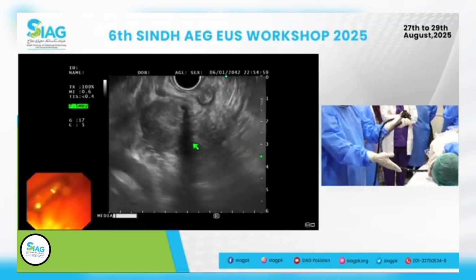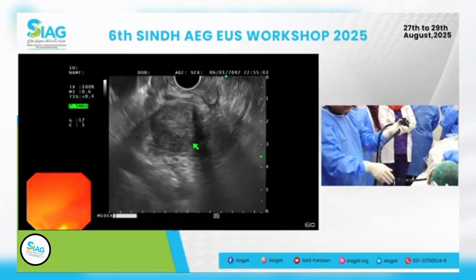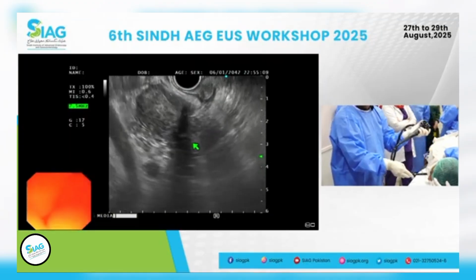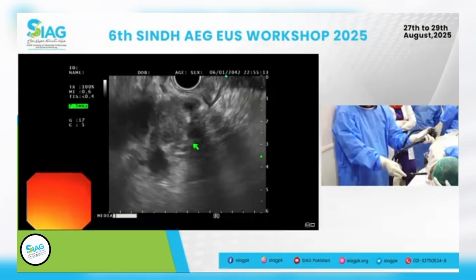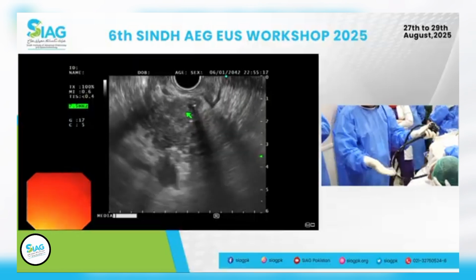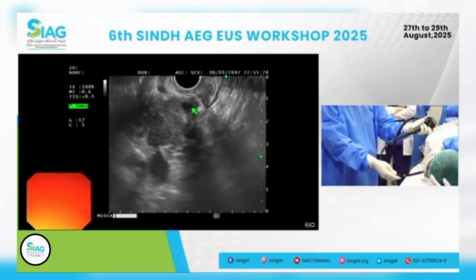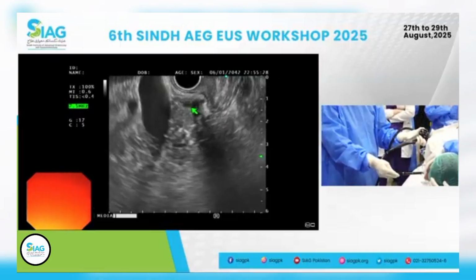So same movement, big wheel towards you. I'm sitting in that position, suctioning. I will move the scope gently in to oppose against the wall. That stabilizes me right there. Now, if I have to go to the liver hilum, I know there is a stent in there. The bile duct is kind of decompressed, but we clearly see the bile duct right there. To go towards the liver hilum, I'll stay in this position, start moving to the left.